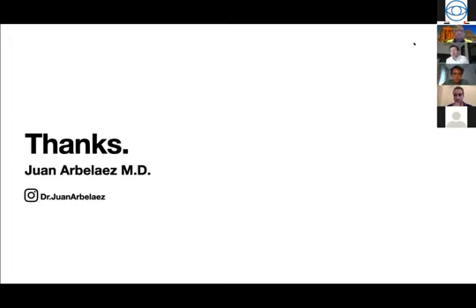Yeah, with very thick corneas, as Shadi was saying, if the calculation is saying that my 80% is 460, I will not implant the ring so deep. I will try to go at maximum. The maximum I go is 420, but most of my rings are implanted around 390 microns.